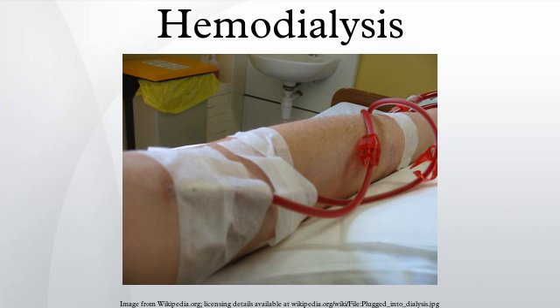In recent years, the incidence of first-use syndrome has decreased, due to an increased use of gamma radiation, steam sterilization, or electron beam radiation instead of chemical sterilants, and the development of new semi-permeable membranes of higher biocompatibility. New methods of processing previously acceptable components of dialysis must always be considered. For example, in 2008, a series of first-use type of reactions, including deaths, occurred due to heparin contaminated during the manufacturing process with oversulfated chondroitin sulfate.